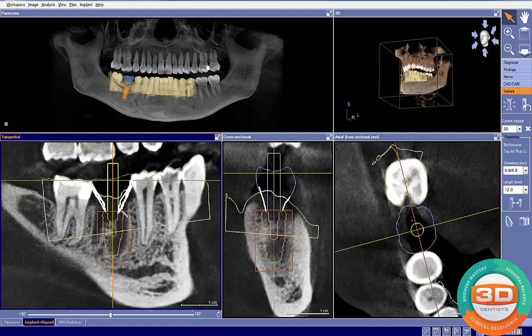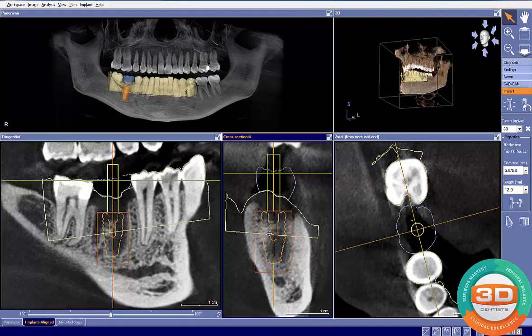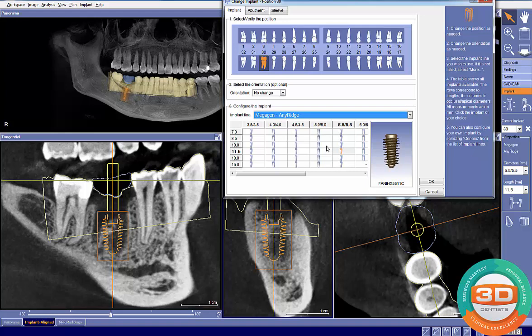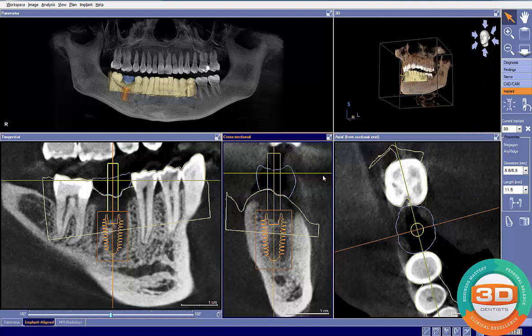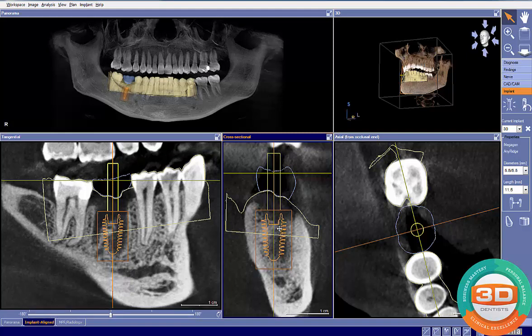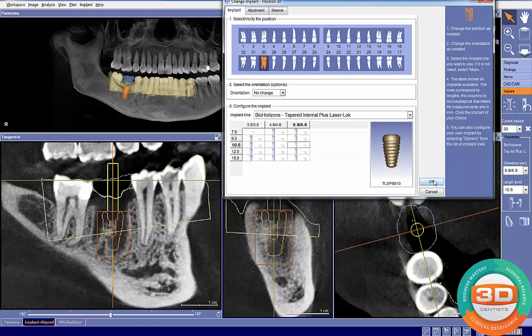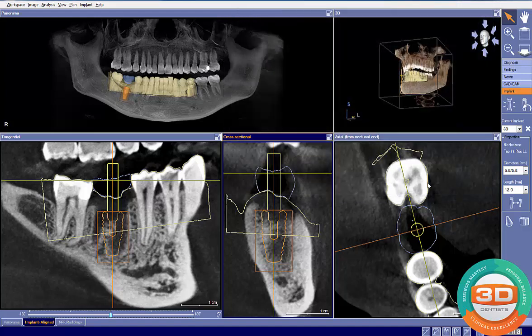Another option is to consider undersizing our osteotomy to allow the implant threads to do the engagement. While keeping the position, we can switch to another type or size of implant. In a case like this, I would possibly consider a 5.5 by 11.5 millimeter Megagen Any Ridge implant, which may give us a little more initial stability. I'm pretty confident that either the Megagen or the BioHorizons 5.8 by 12 would give more than adequate stability for this delayed immediate placement.